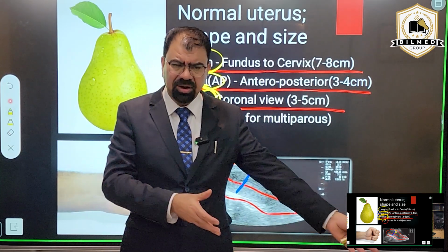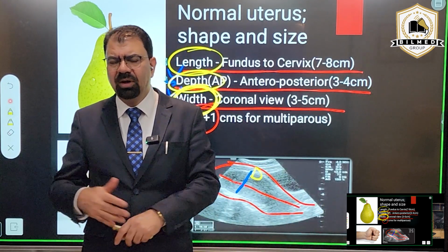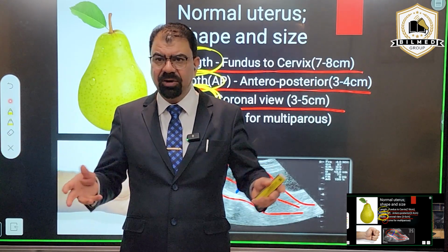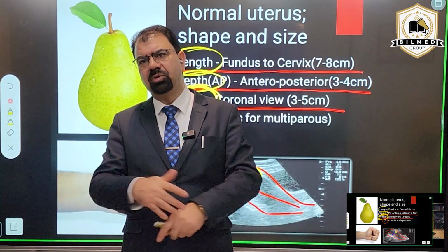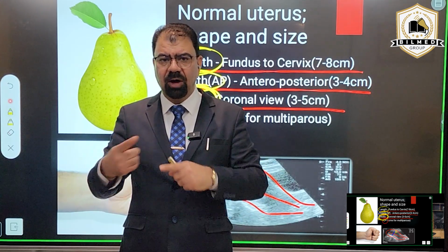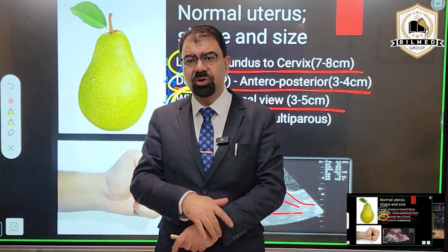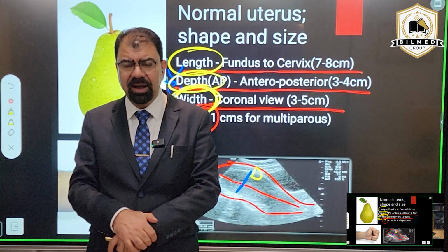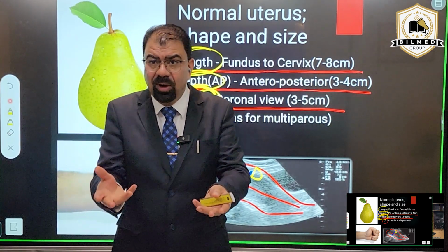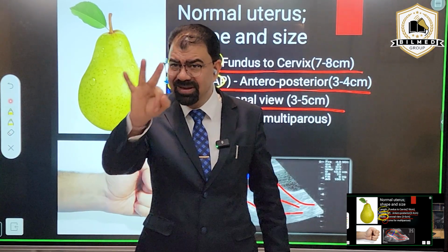Dr. Madhuri, have you not heard of a report that says polycystic ovary, and when you investigated it thoroughly, it was normal, or vice versa, that it was actually a polycystic ovary but was missed on ultrasound? Is that not happening? It is happening, sir. Why? Because for volume, I have to do three measurements.